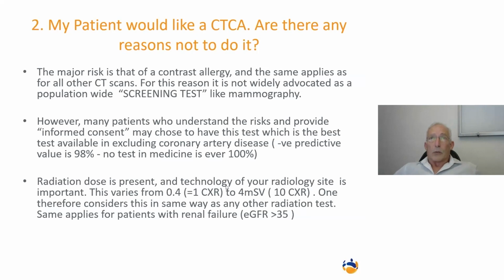So, my patient would like a CTCA. Are there any reasons not to do it? So here we're talking about risk factors, and the major risk factor is that of contrast allergy. It's the same that applies as for all other CT scans that we do: chest, abdo, pelvis, arterial studies, the aorta, head and neck study. And for this reason, because of the contrast allergy, it's not widely advocated as a population-wide screening test.